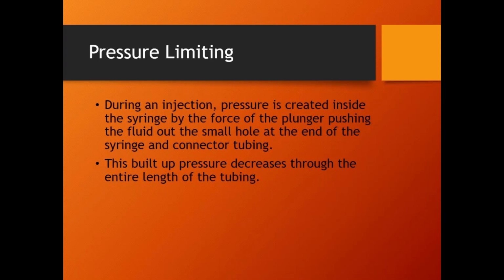And most of the time when you get pressure limits is because they did that. They lowered it down to 100 PSI. They're like, oh man, 300 PSI, that's an awful lot in the left atrium. All right, go 100 PSI. Like the left atrium can handle 100 PSI. So most of the time when you get that, it's because you made your pressure limit too low. Put your pressure limit back up to the maximum, and you'll be able to shoot your shot.